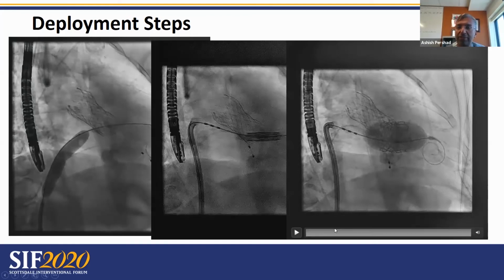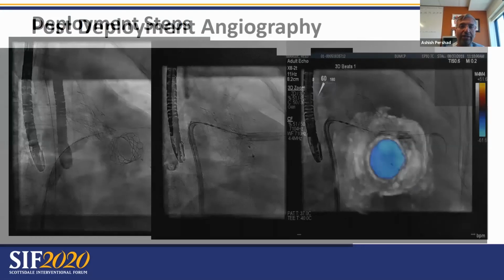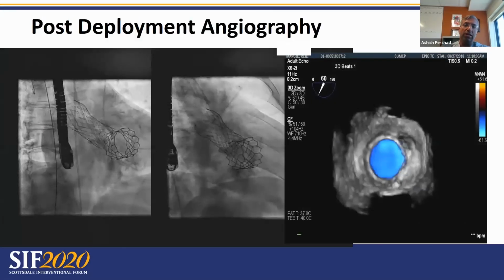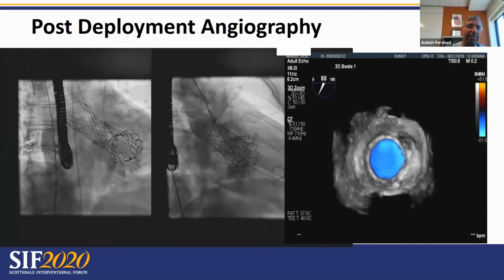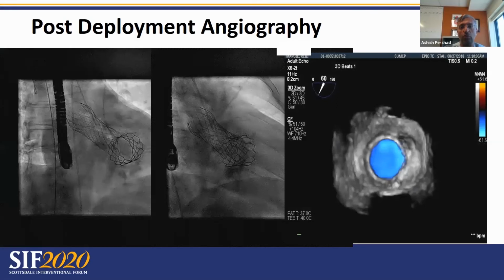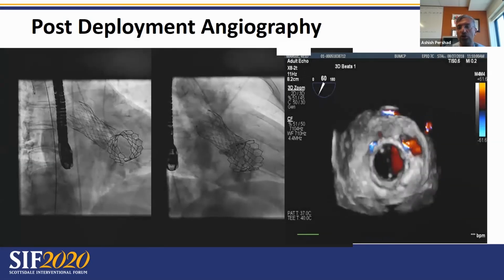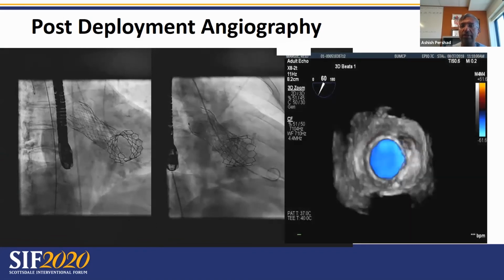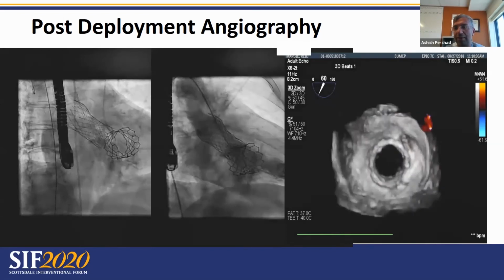And the minute the valve is expanded, we pay attention to hemodynamics to make sure that there's no compromise in the left ventricular outflow tract. Having first established that, and having verified on TEE that the valve location is stable and the deployment is adequate, we then focus our attention on the 3D TEE assessment. And as you can see on the right panel, the valve seems to be working fabulously.